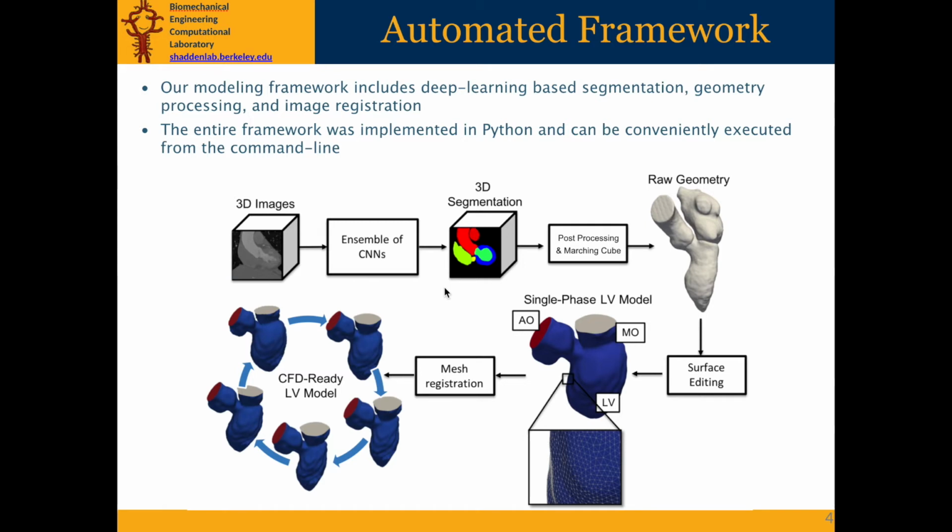aorta structures. We post-process the segmentation to remove any artifacts and then apply the marching cubes algorithm to generate a watertight surface mesh. Surface processing algorithms are then applied to generate LV meshes with appropriate mitral inlet and aortic outlet structures required for CFD simulations.